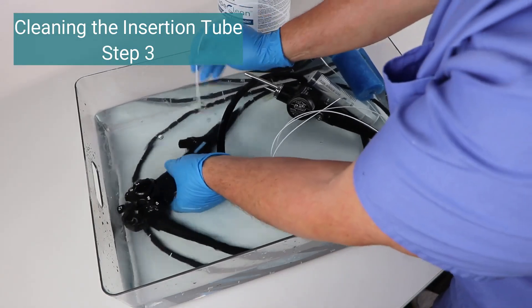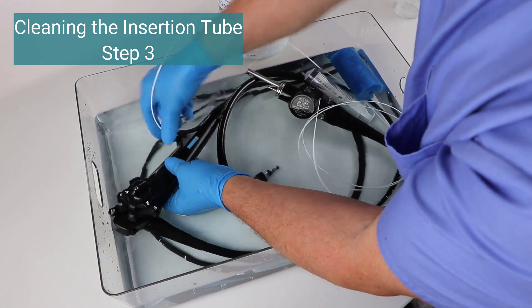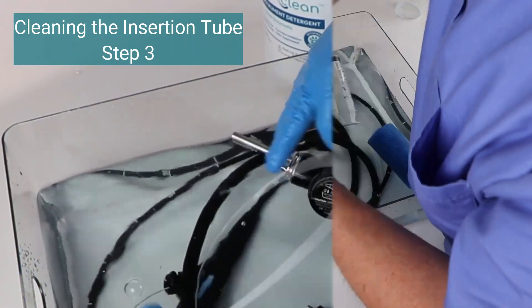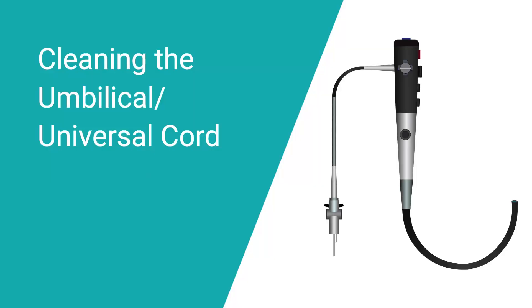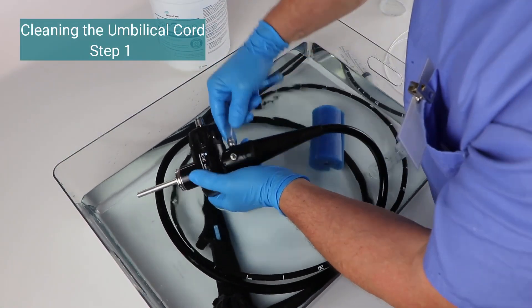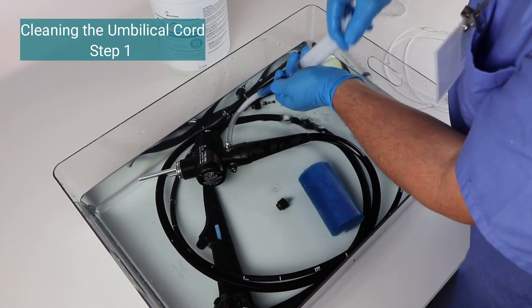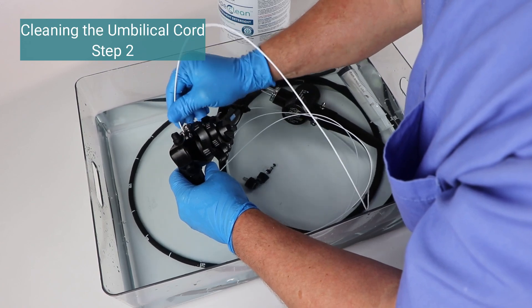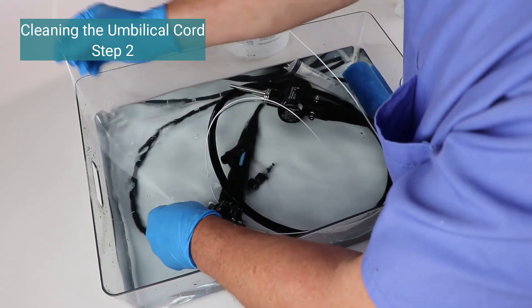Step 3: Use a long cleaning brush to remove debris from the biopsy instrument channel inside the insertion tube. Push the brush through the biopsy instrument port until you see it appear at the distal tip, then gently pull it back out and repeat as needed. For cleaning the umbilical or universal cord — Step 1: Using a syringe with tubing attached to the Christmas tree connector, flush the umbilical cord until the cleaning fluid comes out of the suction port. Repeat 1 to 2 times. Step 2: Rinse the brush in the cleaning fluid, then push it down the umbilical cord until it comes out through the Christmas tree connector. Gently pull back on the brush and repeat as needed.